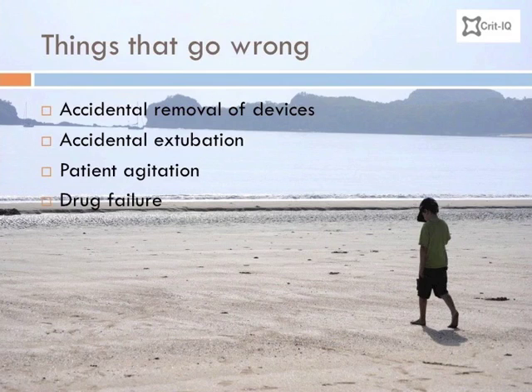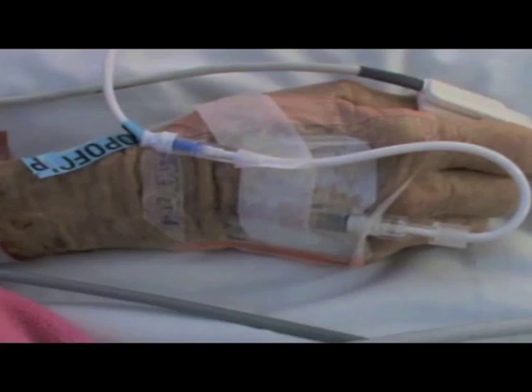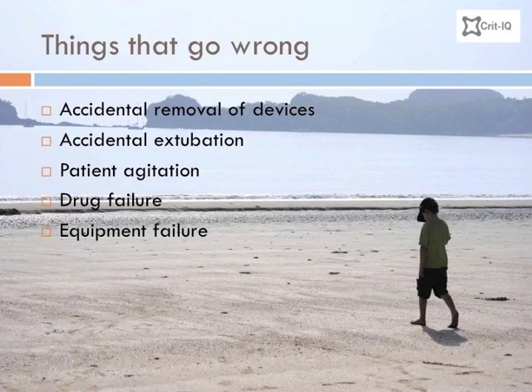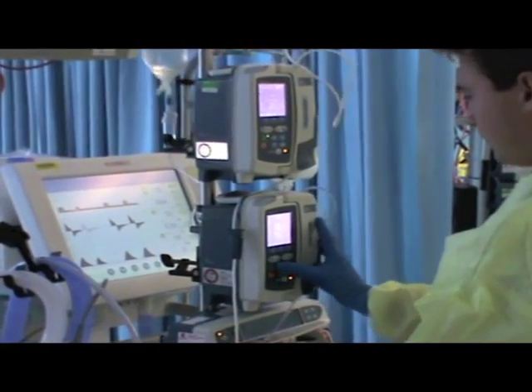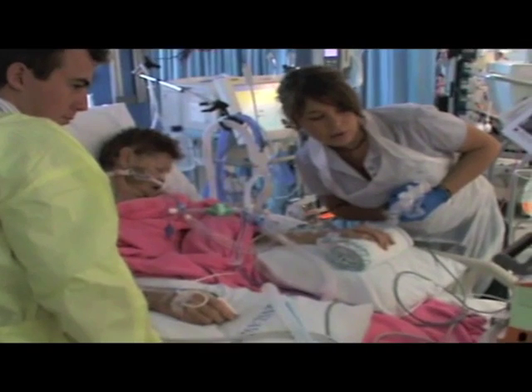Infusion pumps and fluids may run out during transit, and other drugs may be required. Failure to recognise this may lead to serious complications, such as acute hypotension. All equipment may fail due to flat batteries or due to mechanical issues. It is essential to consider the impact of these failures on the patient. Battery duration of important equipment must be checked and contingencies considered in the event of a failure.